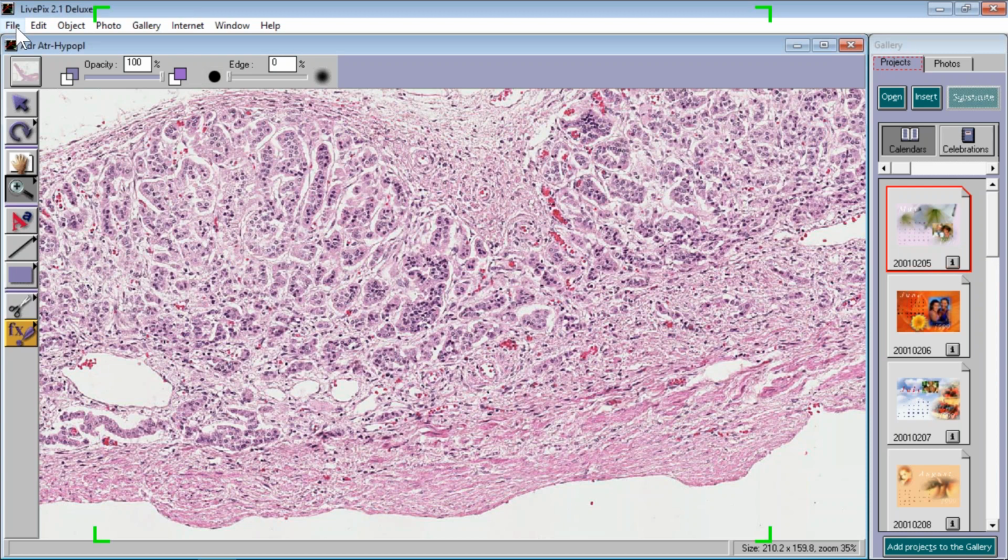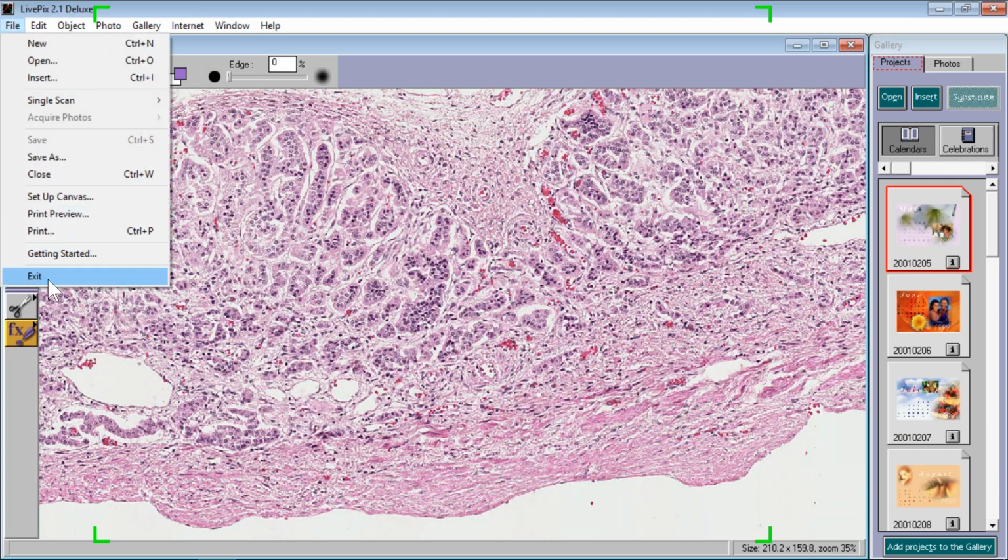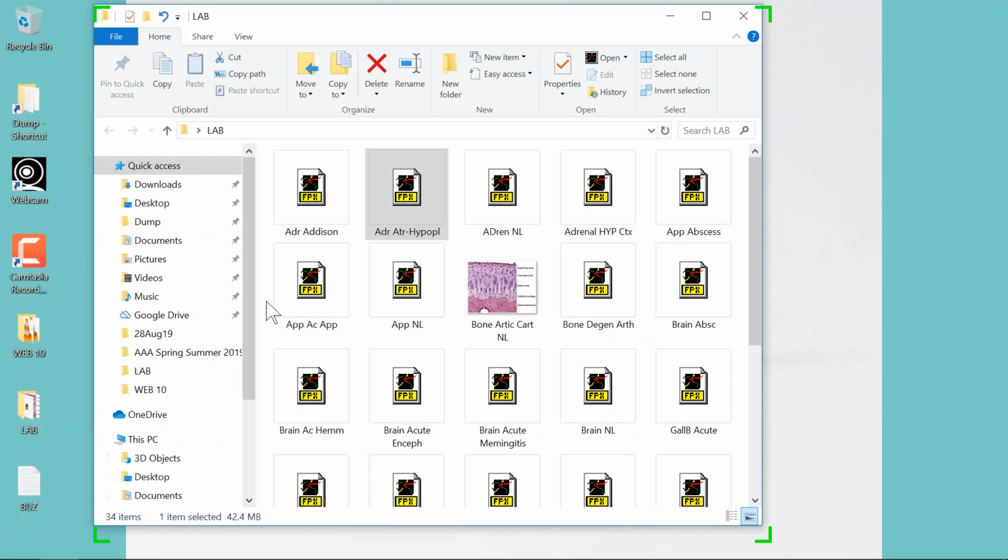I'm going to show you another interesting case here. And these are all things that we have talked about, okay? These are all cases that we have talked about in the last 10 webinars. So if you weren't at any of the previous webinars, you might be a little bit lost. And also, if you had not had any experience at all with histology or normal histology, you may also be lost. So I'm making a couple assumptions here.